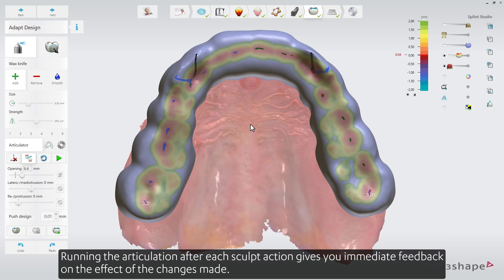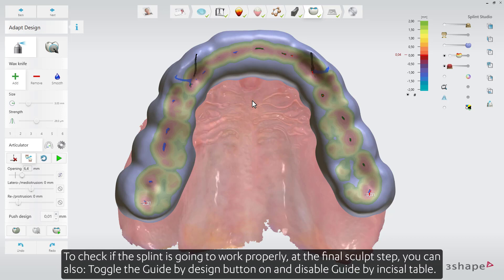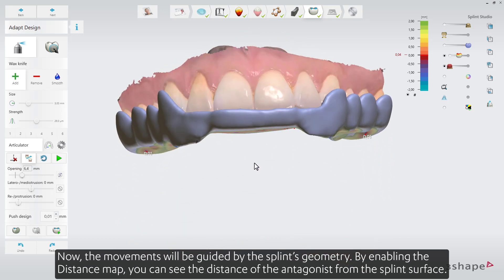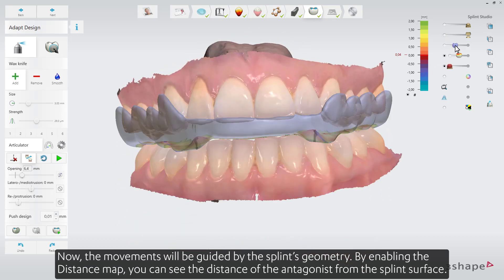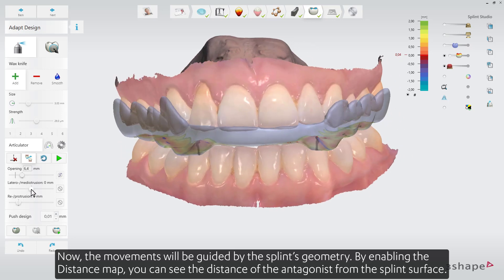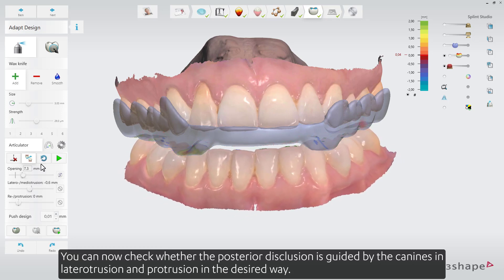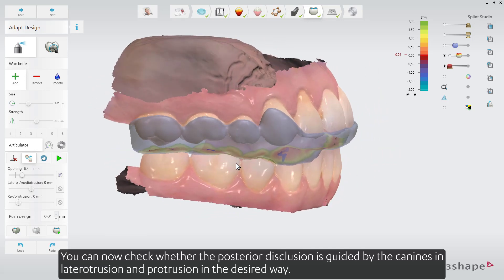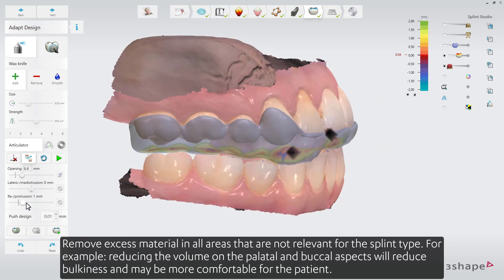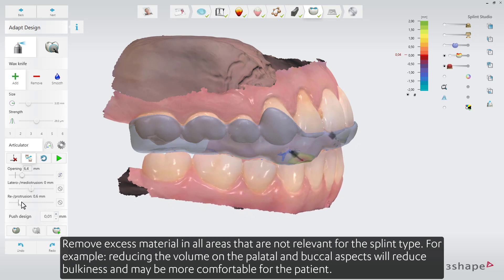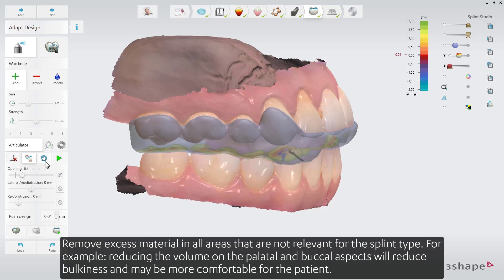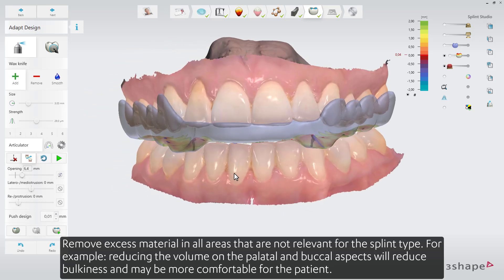Running articulation after each sculpt action gives you immediate feedback on the effect of changes made. To check if the splint is going to work properly at the final sculpt step, toggle guide by design on and disable guide by incisal pin — the movements will now be guided by the splint's geometry. By enabling the distance map, you can see the distance of the antagonist from the splint's surface and check whether the posterior disclusion is guided by the canines in laterotrusion and protrusion. Remove excess material in all areas not relevant for the splint type; for example, reducing volume on the palatal and buccal aspects will reduce bulkiness and may be more comfortable for the patient.